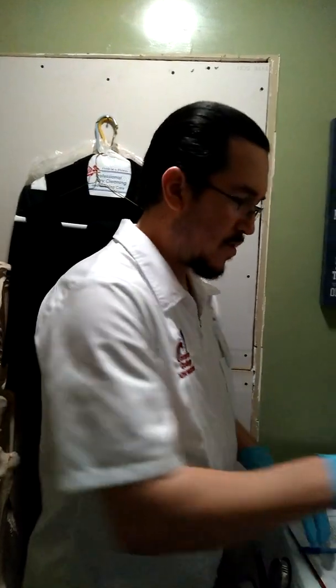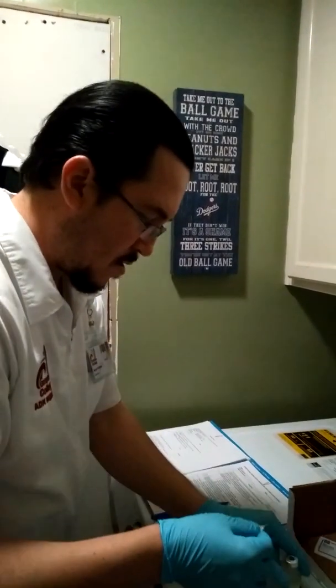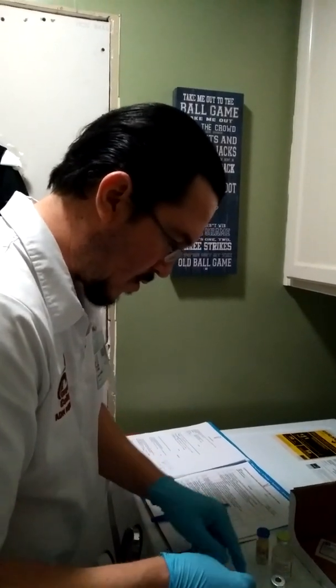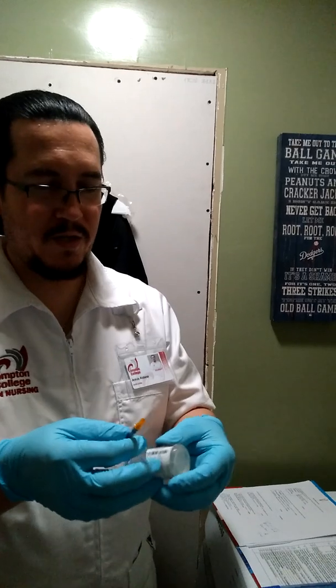What else? Okay, so now I'm gonna have to draw the correct amount of medication. First I have to clean the top of the vial. Okay. Next, I make sure I put the medication inside the syringe.